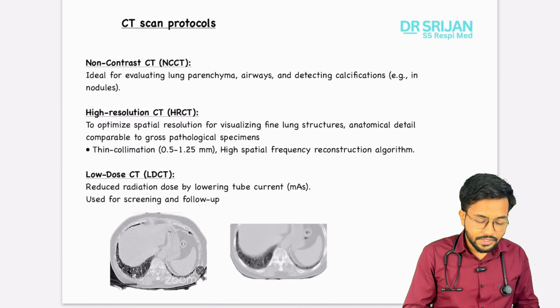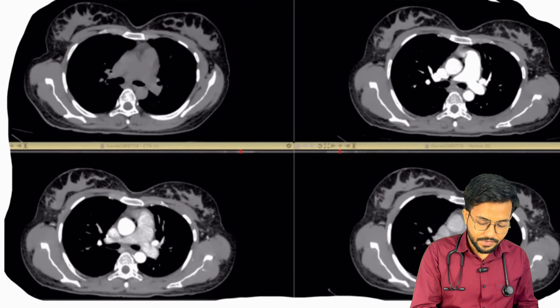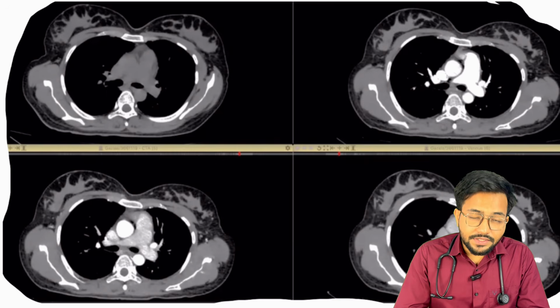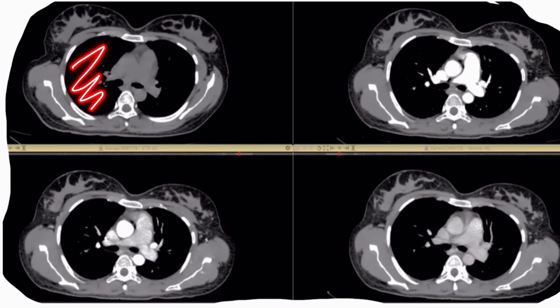So once we are done with the CT scan, I want to show you this image. Now see, first question is this a lung window or is this a mediastinal window? The lung parenchyma is not visible clearly, but I can delineate the mediastinal structures, but not clearly.